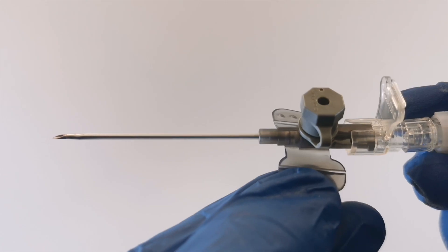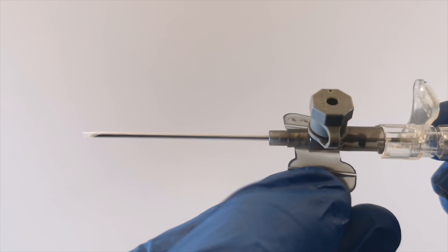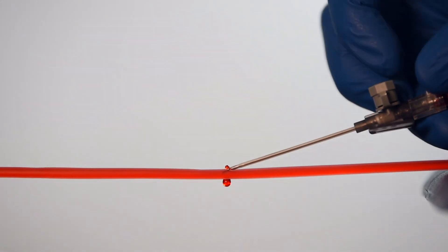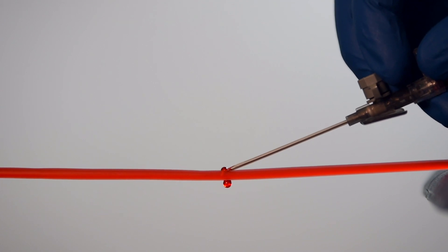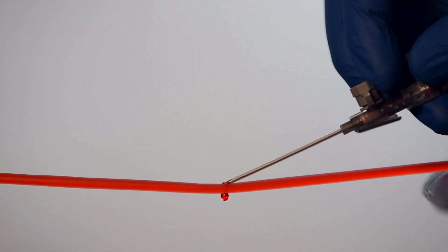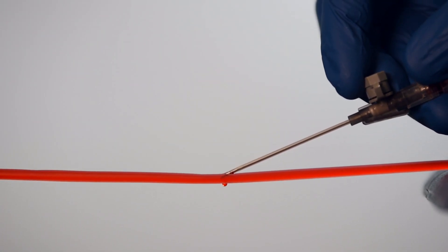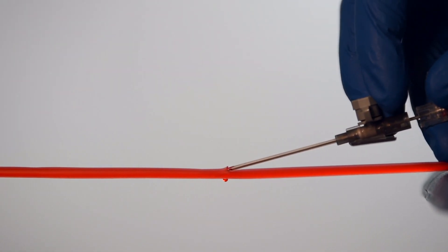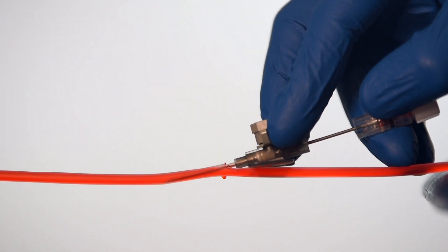There's a small distance between the tip of the needle and the plastic tube, which means you may not be entirely in the vein even if you're getting blood back in the chamber. The tube should advance smoothly off the tip of the needle. If you cannot advance the tube, you might have the needle tip in the vein but not have the plastic tube. Put the needle back all the way into the cannula and try to advance the whole cannula a little further into the vein - just a couple more millimetres. You might even feel a give as it goes through the side of the vein wall, at which point you should try to advance your tube off the tip of the cannula again.